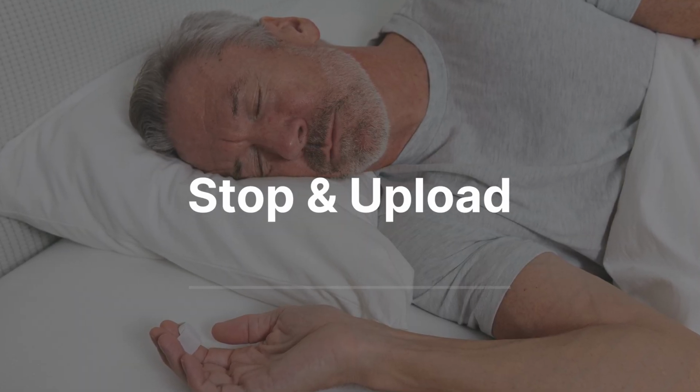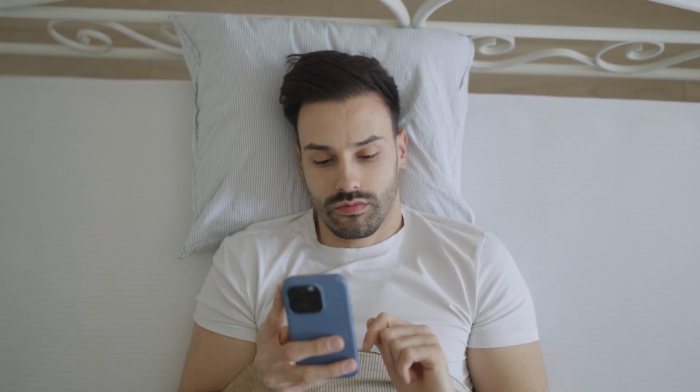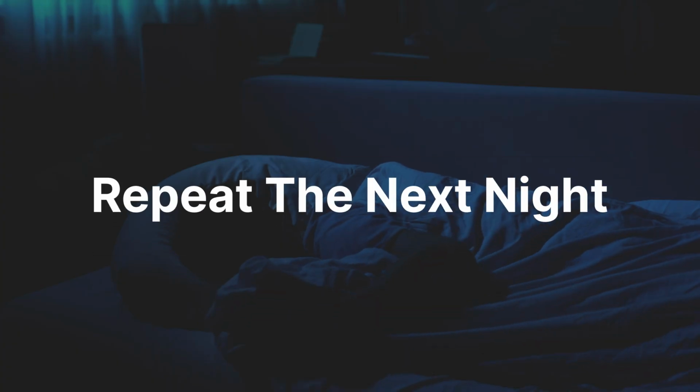Step 5. Stop and upload in the morning. When you wake up, open the app again and tap stop recording. Your data will start uploading automatically. Just stay on that screen until you see the message that the upload is completed. That means you completed night 1. Great job.